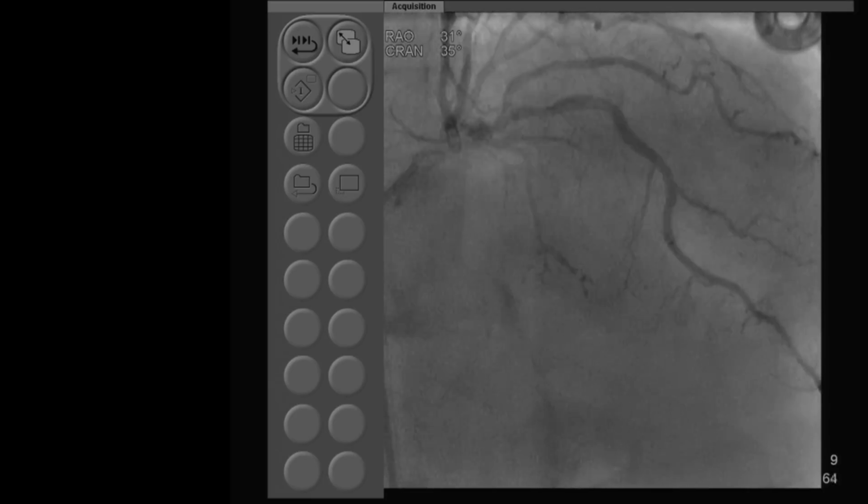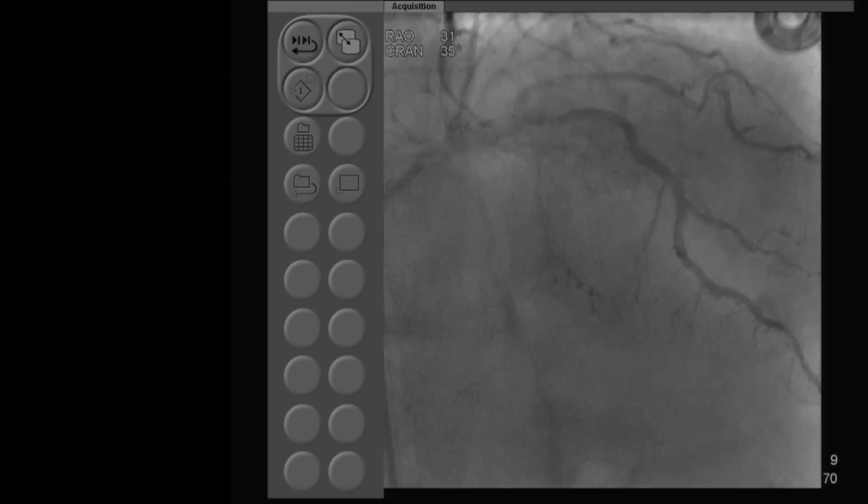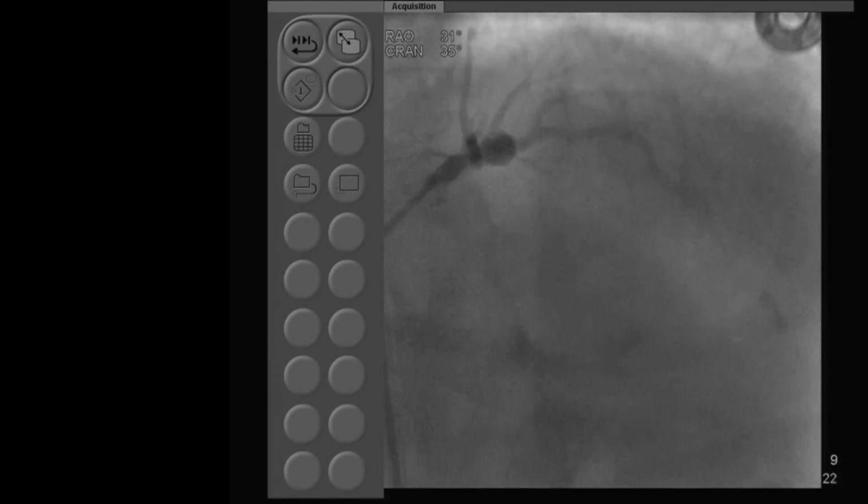You think there is a filling defect, thrombus in the aneurysm? Well, that always happens, a little bit of thrombus right there on the top. How does that change your strategy, Sameer? No, we knew about it. The idea would be that we put a stent across and the aneurysm will fall down.